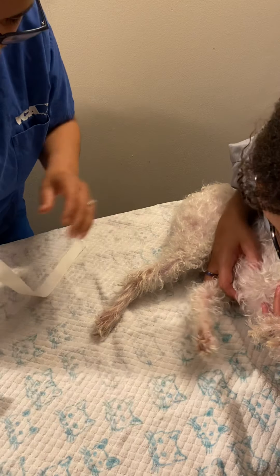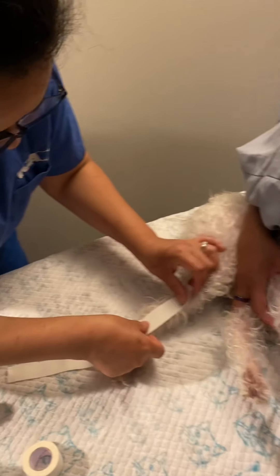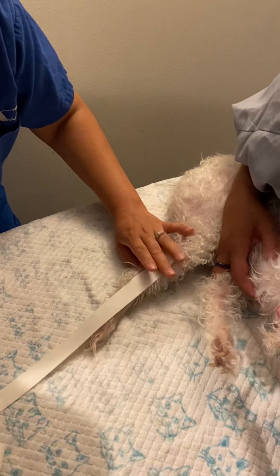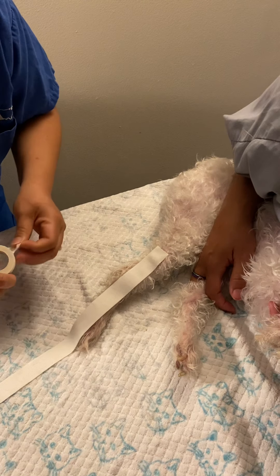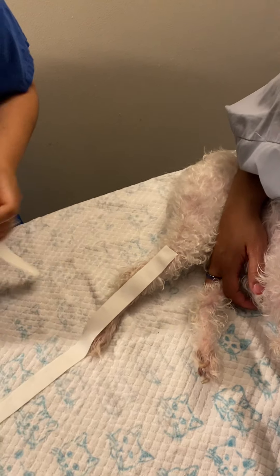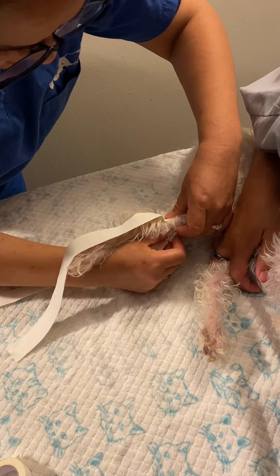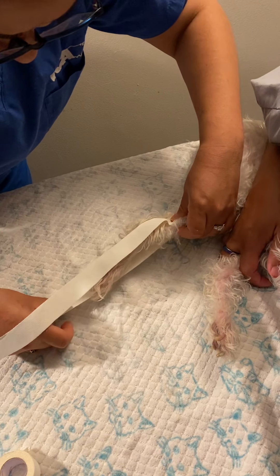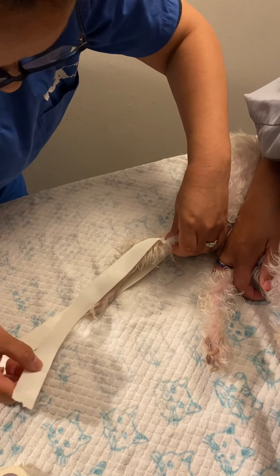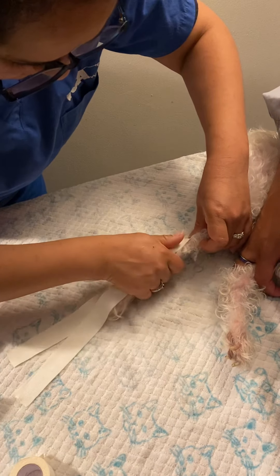We're going to pick the size and go one on the top and one on the bottom. A lot of times I'll use a tongue depressor so they don't stick together. This is just so that our bandage doesn't roll off when we're placing it.